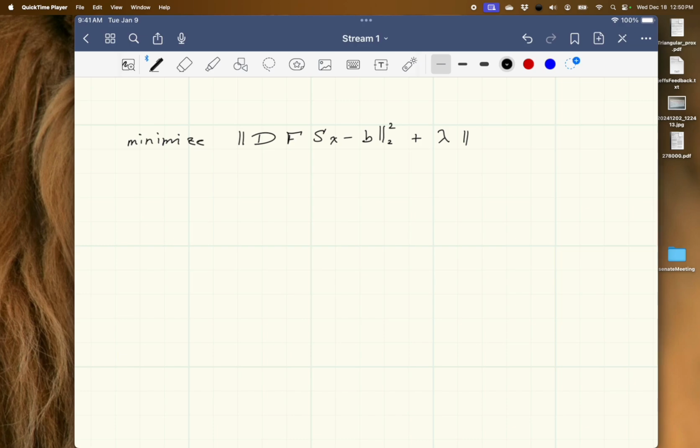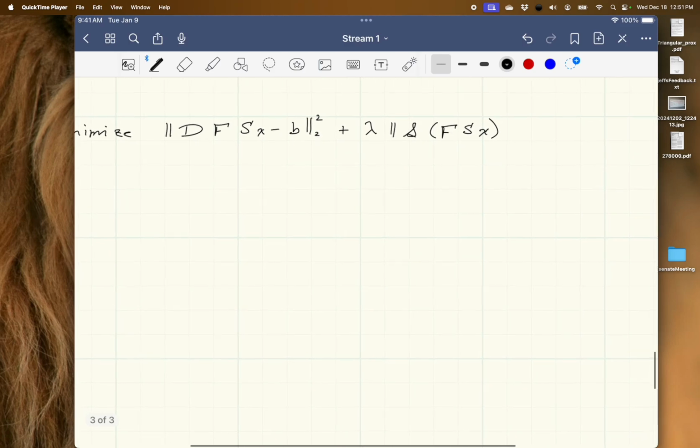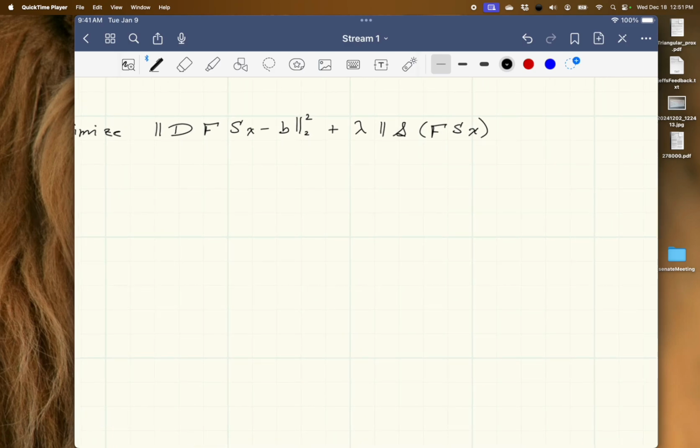And what we're going to say is, so I'm going to let, well, if I apply the SPIRiT kernel, if I do all of the interpolations to the quantity f, s, x, so these are the Fourier values, ideally, if we knew x correctly, if x was right, we would get back the same thing.